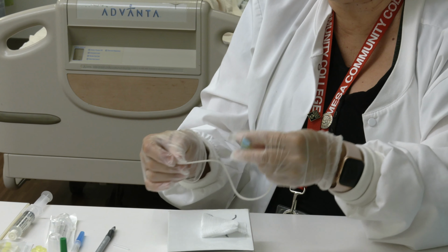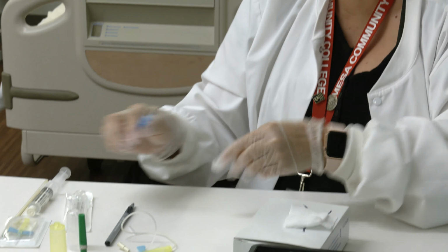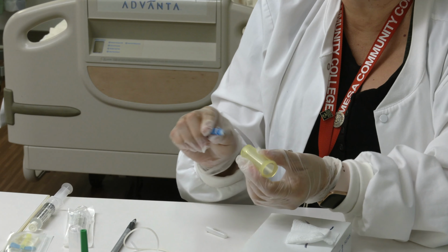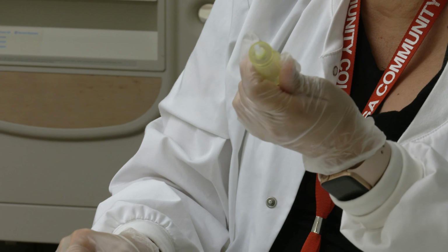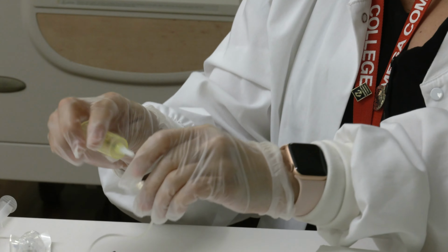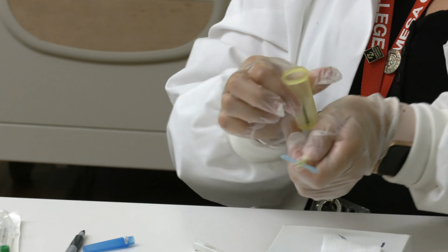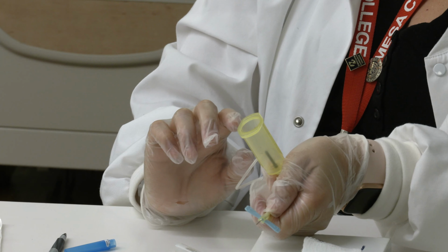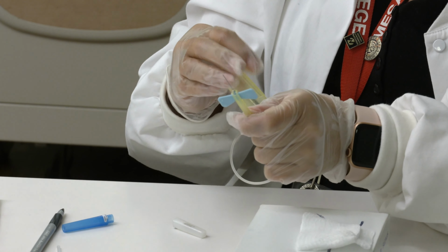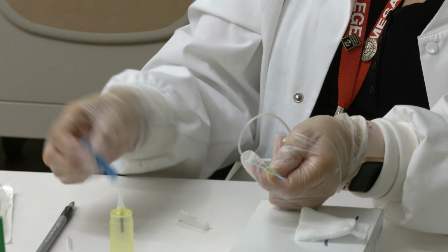The other way you can do this is to use what we call an alternate Vacutainer needle. So now if you notice, there's no needle on this because you're going to use it with another piece. So I can still use the same technique of going in, but now I can just use the Vacutainer tubes and fill them all up. So there's tons of different ways to draw labs, but you have to know which apparatus goes with which apparatus.